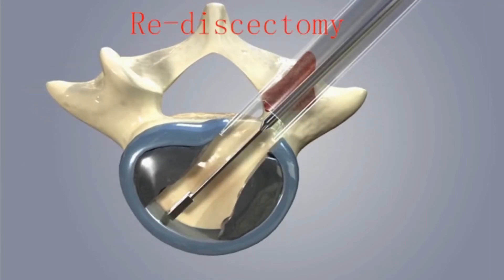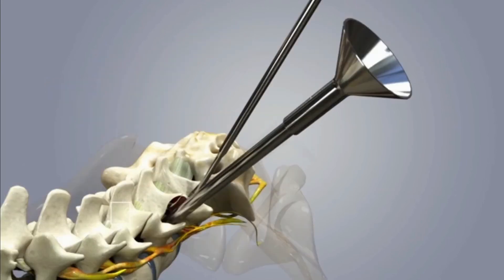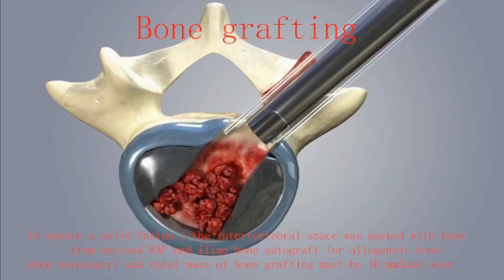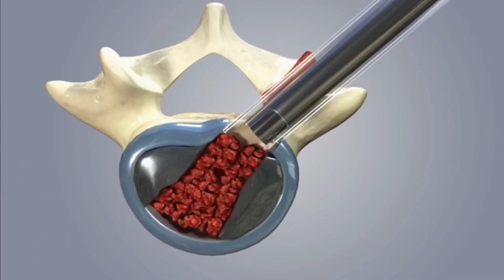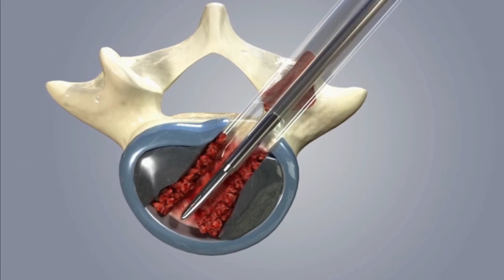After the end plates were adequately prepared, the endoscope was taken out and graft bone was implanted through the implantation tube. The total mass of bone grafting must be 5 cubic centimeters and over. An expandable cage was then inserted into the implantation tube.